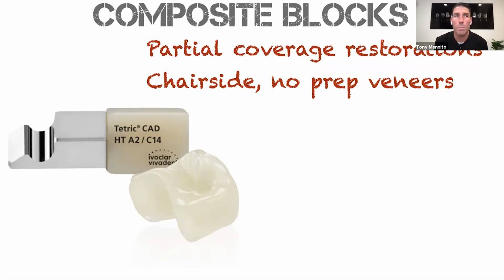There are some times when I'm working in a patient's mouth and we've got this big cavity preparation, and basically the tooth is treatment planned for a direct restoration. And I take a deep breath and I say, I don't really feel like building this up little by little, 2 millimeter increments with my direct composite. I'm just going to scan this patient and mill something and charge them for the direct restoration. I do that quite a few times just because I feel like I can give them a better result that way.